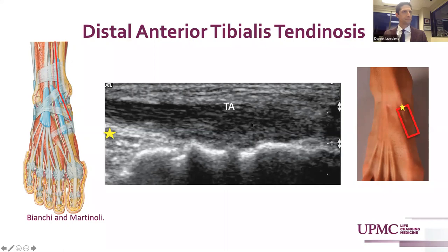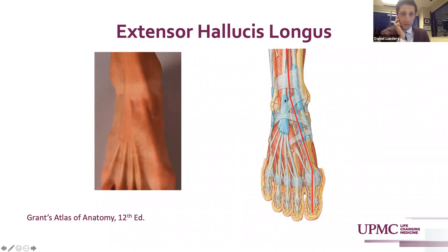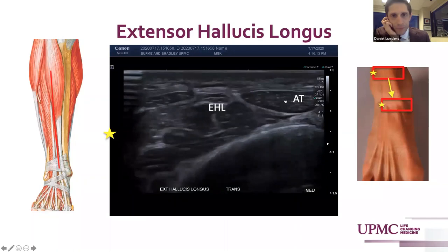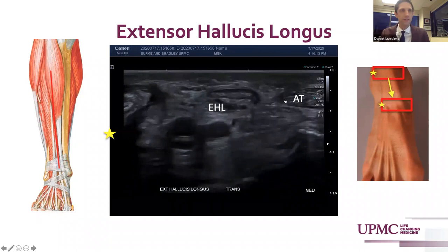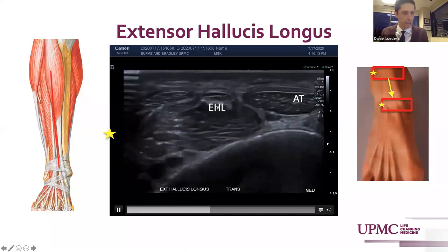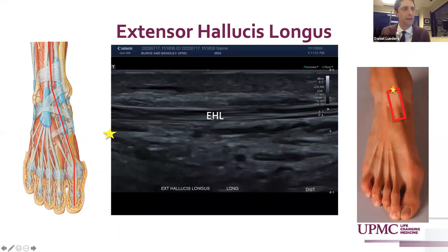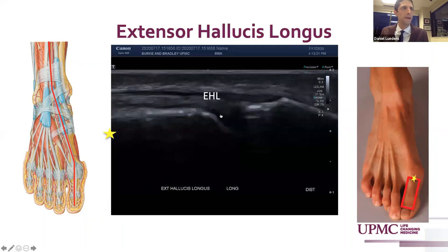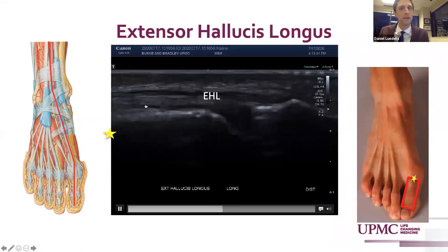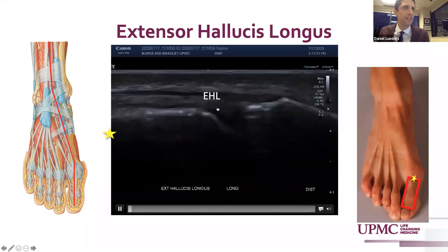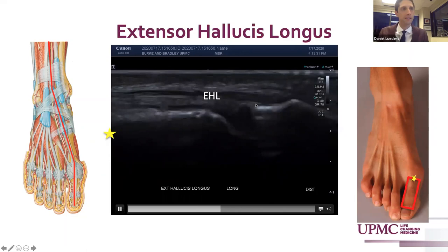Moving laterally across the anterior ankle in the extensor compartment, the extensor hallucis longus lies between the tibialis anterior and the extensor digitorum longus tendon at the anterior ankle. It has a relatively thin tendon compared to the anterior tibialis and extensor digitorum laterally. It maintains that distinct flattened ovoid structure as it courses over the dorsal medial foot. In long axis it maintains a distinct laminar appearing hyperechoic tendon, which can be traced all the way distally to its first toe distal phalanx insertion and dynamically assessed with great toe extension and flexion.